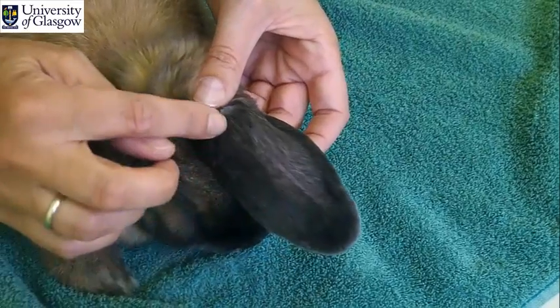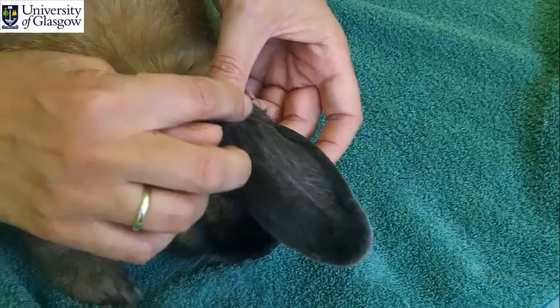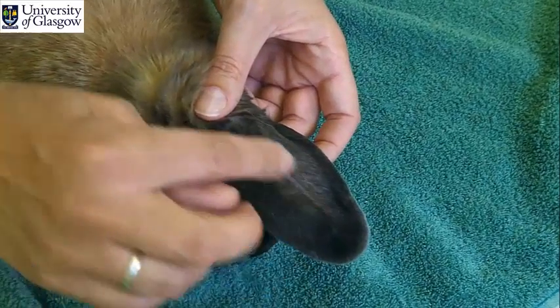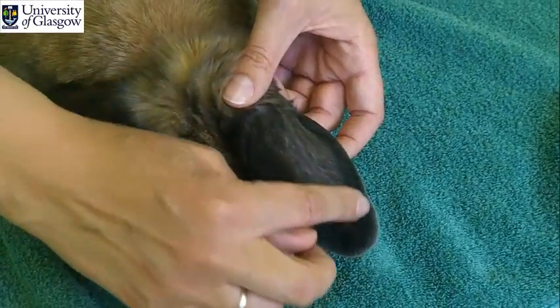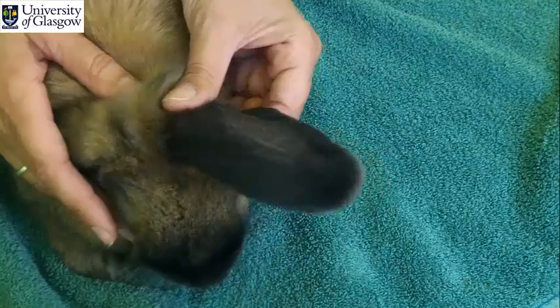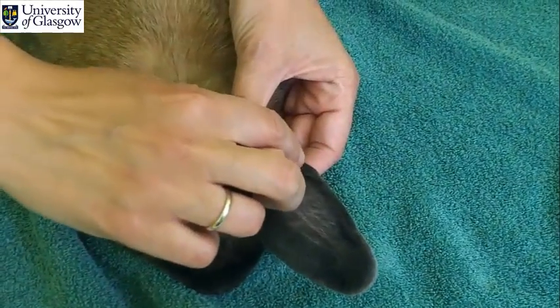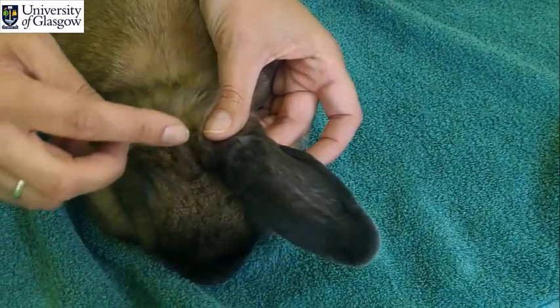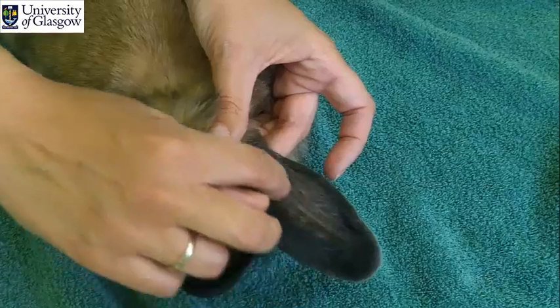Right in the middle of the pinna, we have the artery. This is the central ear artery, and we do not want to take blood or do injection inside the artery. So for intravenous injection, we can use the marginal ear vein, but we do not want to use the central ear artery.